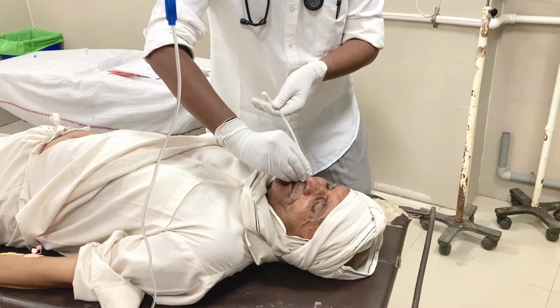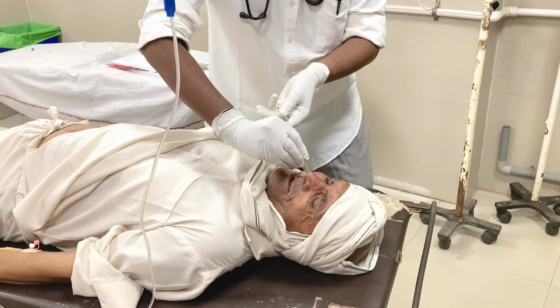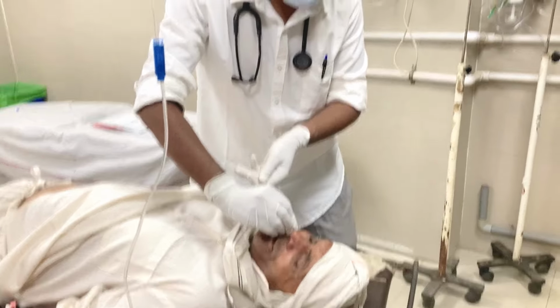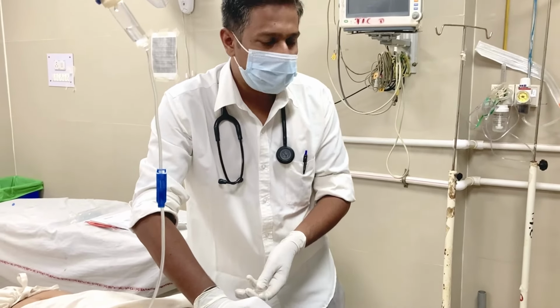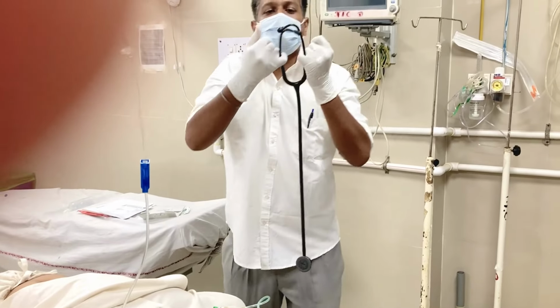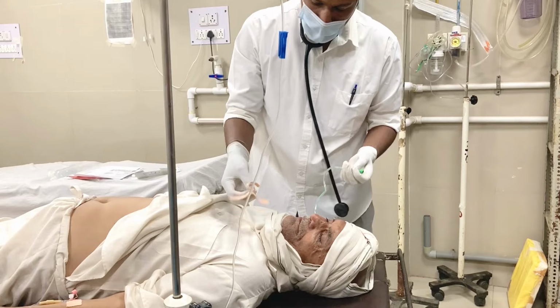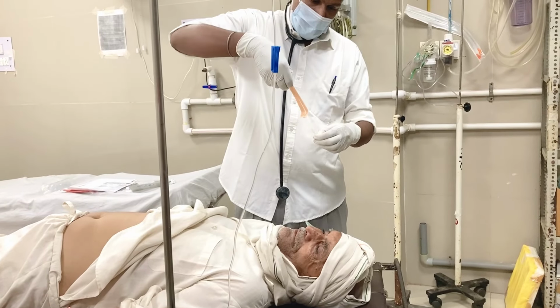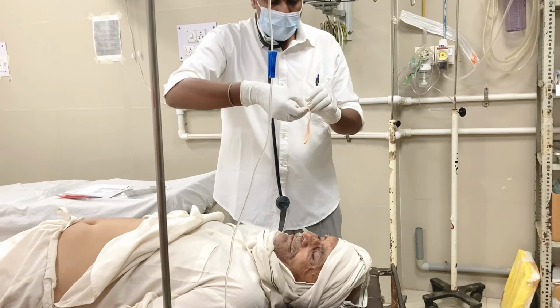And now we can continue to insert the Ryles tube down the esophagus. And once you reach the desired nasogastric tube insertion length, you can fix the nasogastric tube to the nose with the dressing, as we are showing here, to keep it positioned in place.